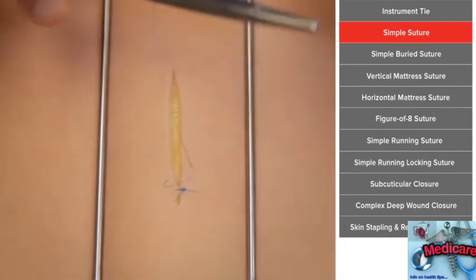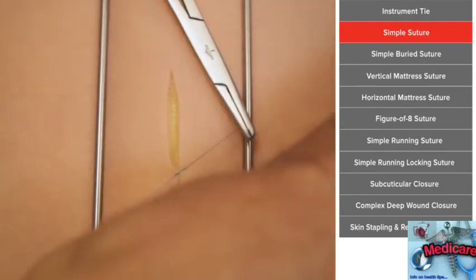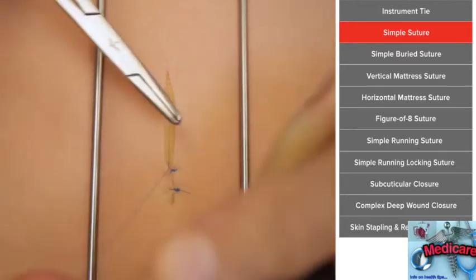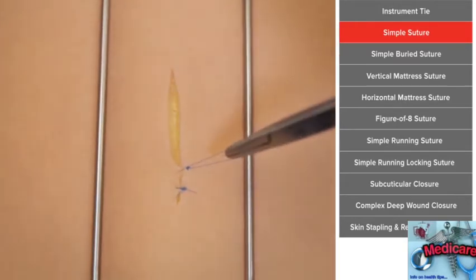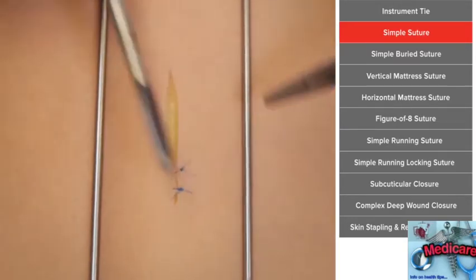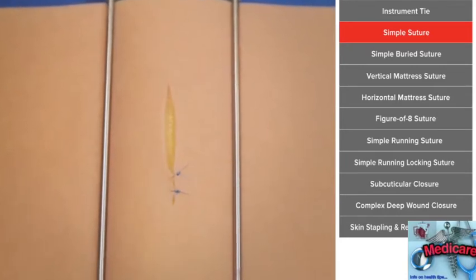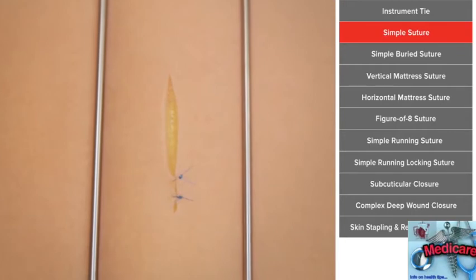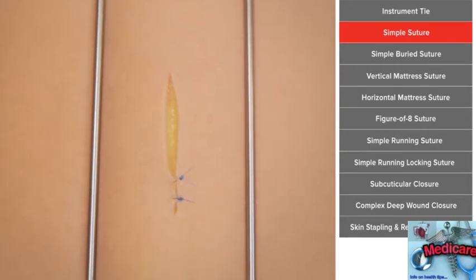So the key, enter at 90 degrees. Sometimes you can keep it in, but you push the skin just to make sure you're getting through it at 90 degrees. And again, that's going to help you to reapproximate your skin. Now you'll decide how far apart each stitch needs to be. The closer they are together, the more stitching you're going to be doing and the more scar you may have. Some tissues are already just about approximated, so you don't need that many.